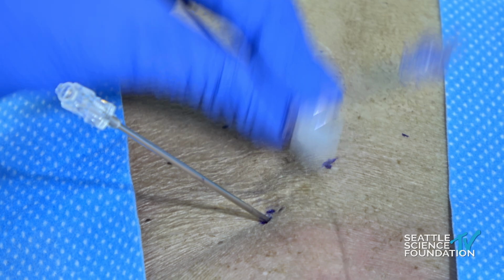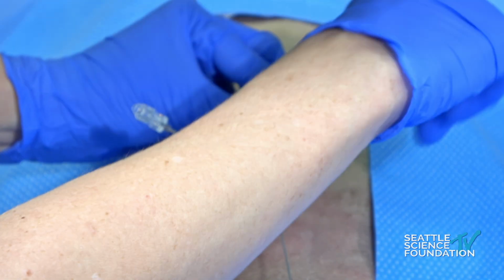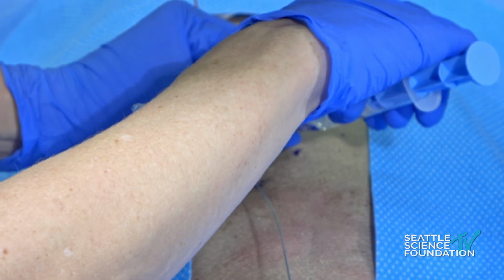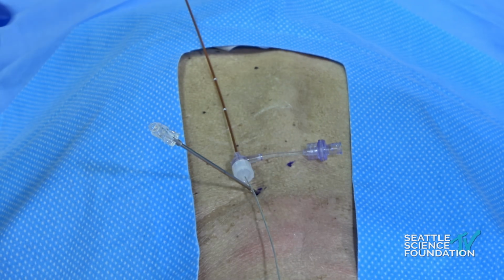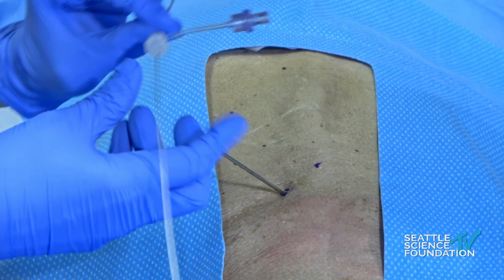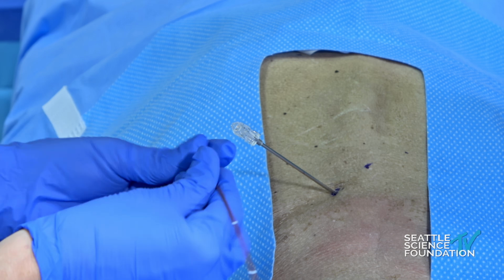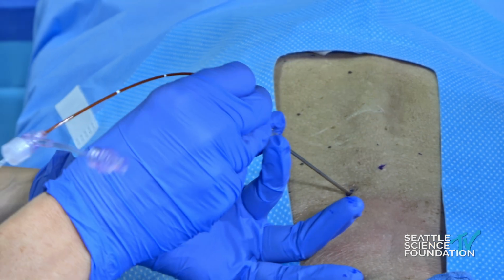The next step is to put some saline in through the side port. And the reason for that is because then it will lubricate the entirety of the sheath so that there's just a little less chance of the lead grabbing as I try to advance it.